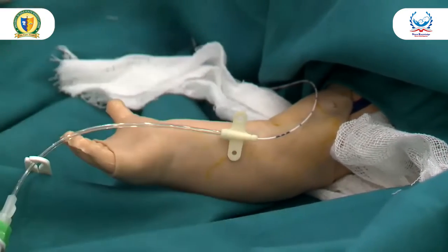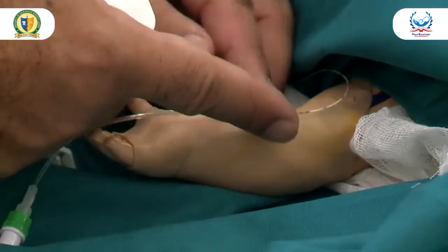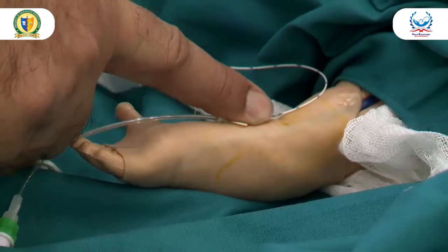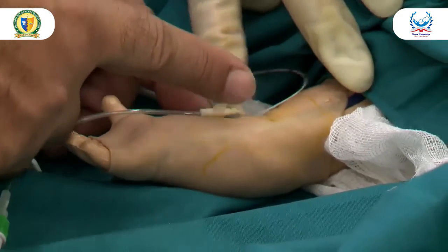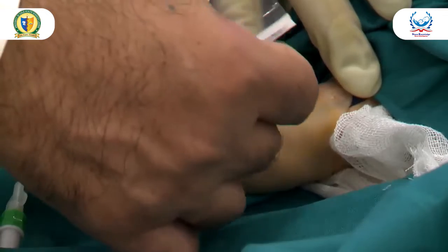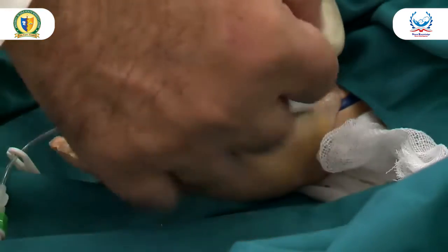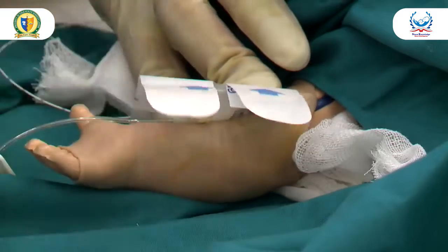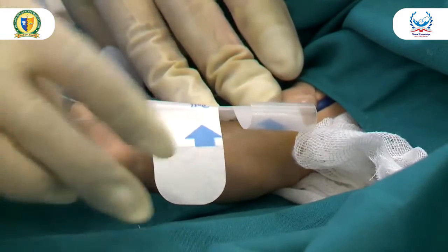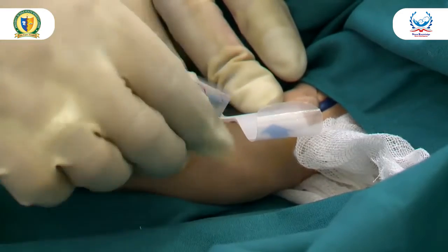Once you do it with your own hands, you... so let's say this is like this. Sonia, can you put it? You don't even need any gauze because there is no hub. Just one transparent dressing is good enough. You can see the entry site of the line.